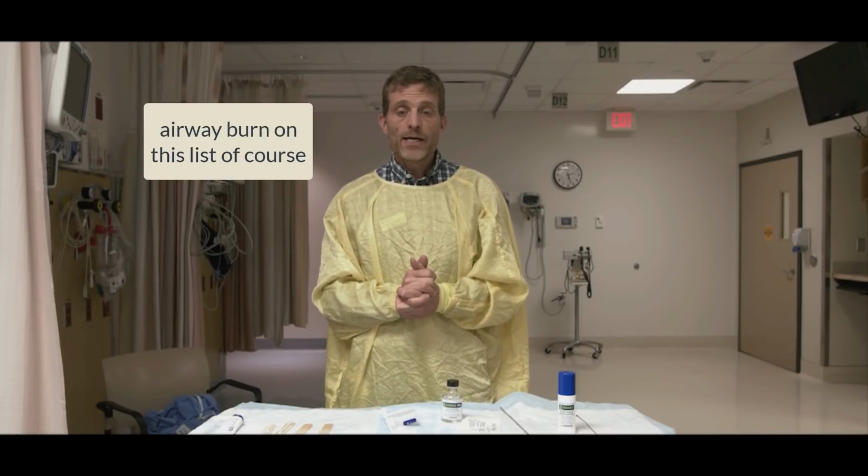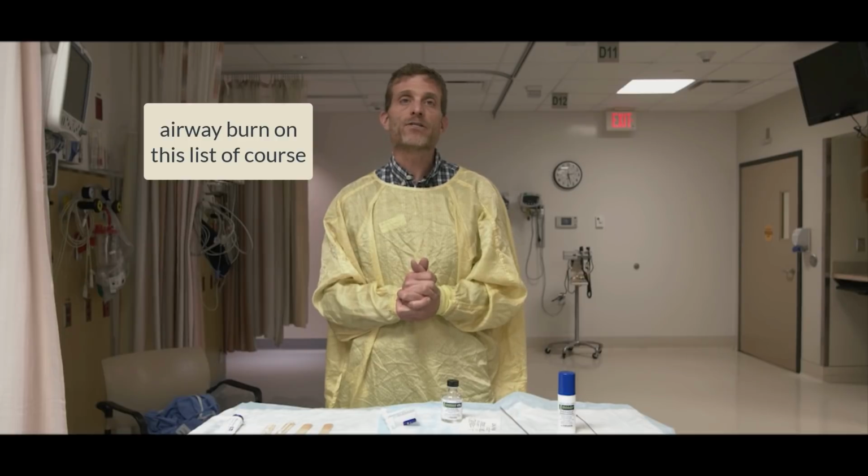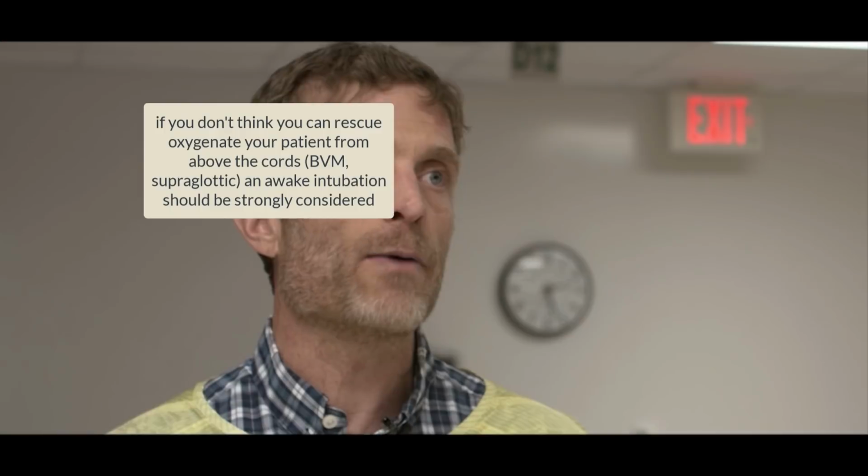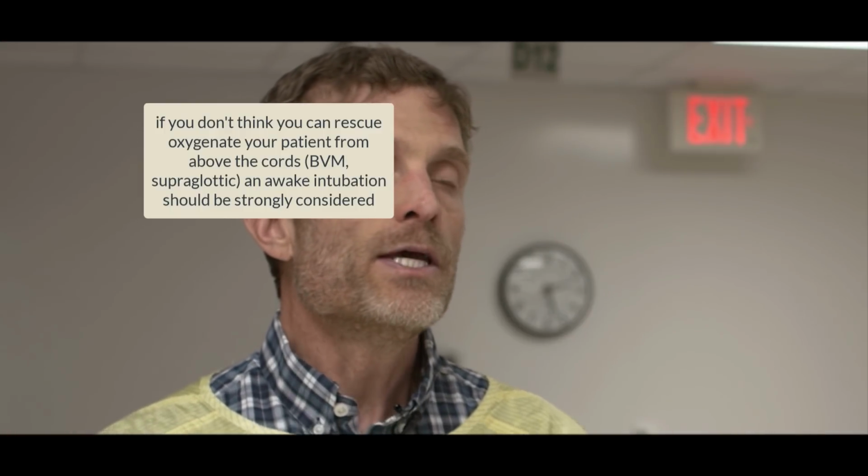And then as far as indications for this procedure, again, the classic indication is somebody with obstructing airway pathology. If somebody comes in with some kind of aggressive infectious process, maybe a traumatic expanding hematoma, anaphylaxis would be on that list, although we have a very good antidote for anaphylaxis, so knock on wood, I've never had to intubate somebody with anaphylaxis. You want to keep those patients breathing. They are doing whatever they can to splint their airway open at that moment. And if we can allow them to continue to do that, we're not burning any bridges, so to speak.